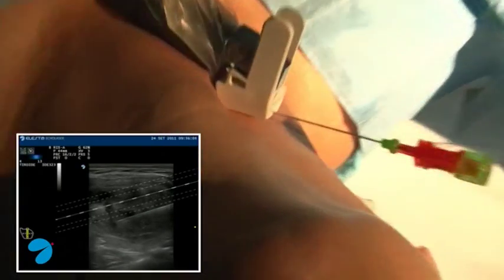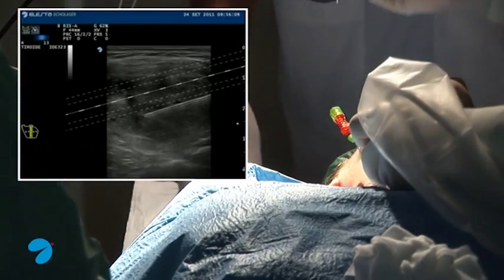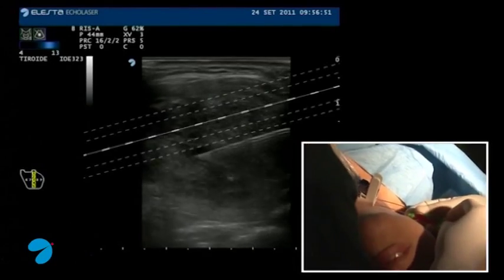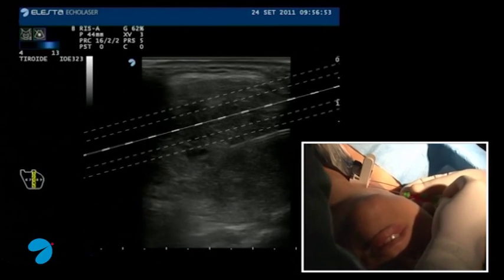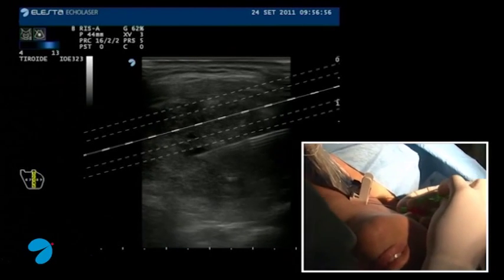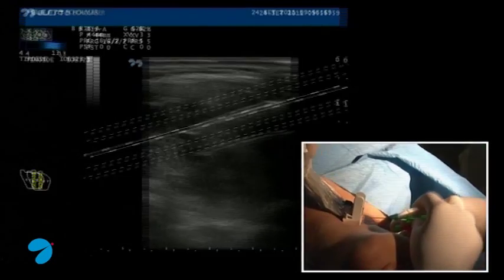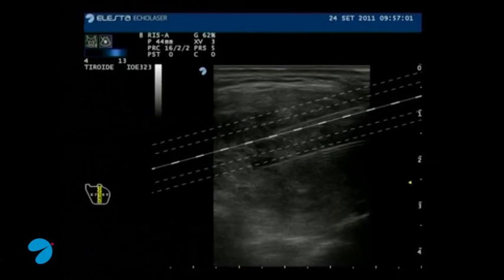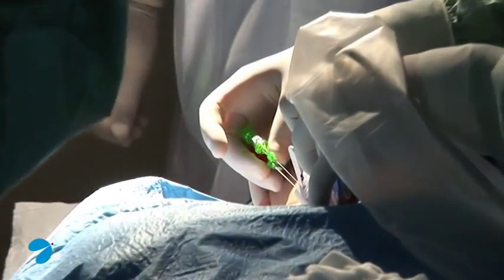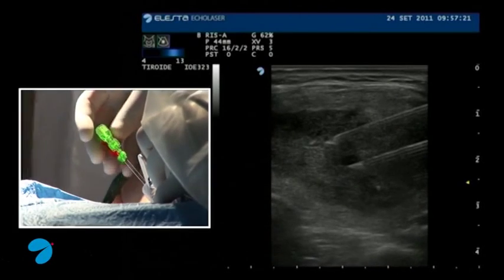We can see the insertion of the first needle following the last line of the guide system, and the insertion of the second needle following the third line of the same guide. We have the possibility to use five guidelines. It is important to place needles at an appropriate distance from vital structures like the trachea and vessels.